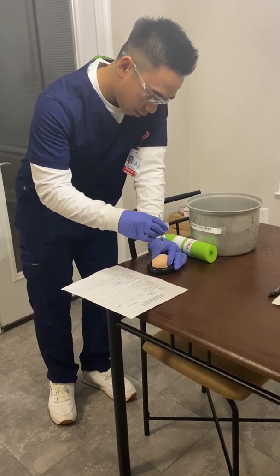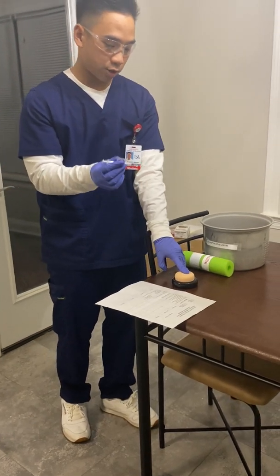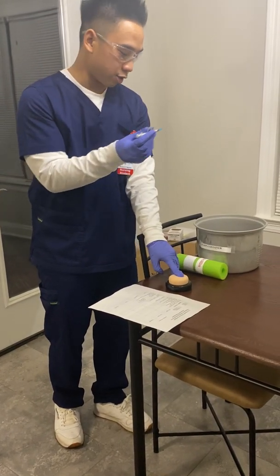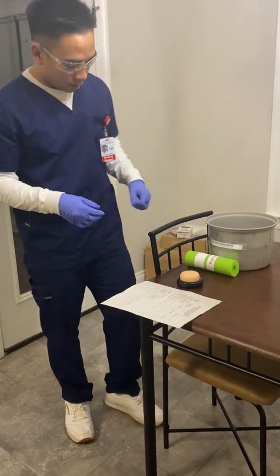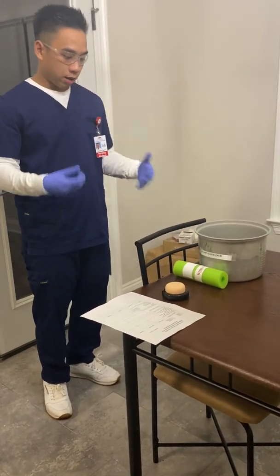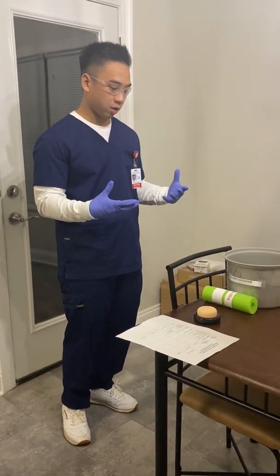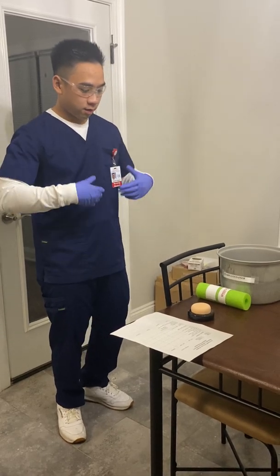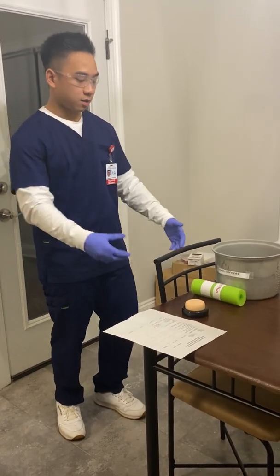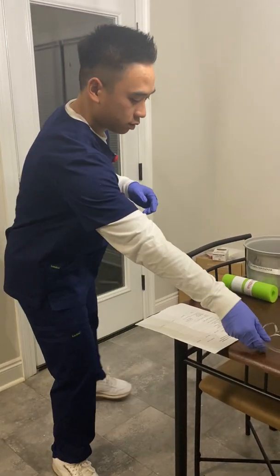All right, so you're going to pull it out. You're going to apply pressure, but you're going to make sure you don't rub or massage. You're going to dispose of the syringe into the proper sharps container. So after you do that, you're going to lower or raise the bed back to its original position. You're going to position the patient comfortably. Then you raise the side rail. You're going to take off your gloves and goggles.